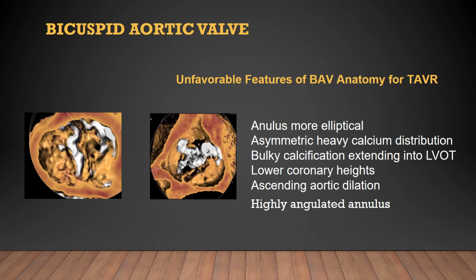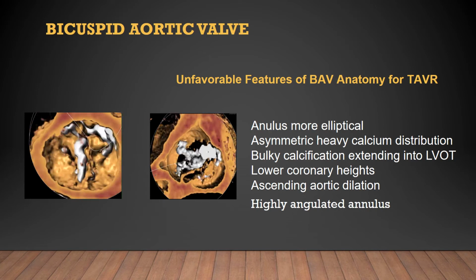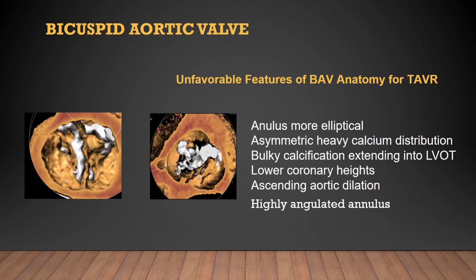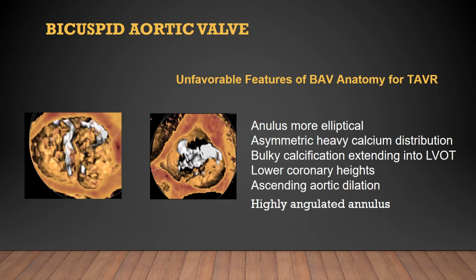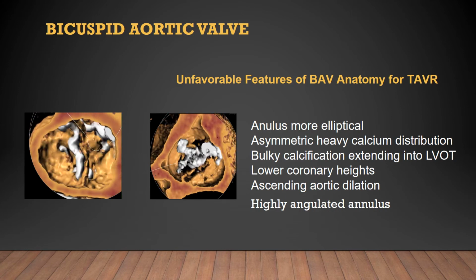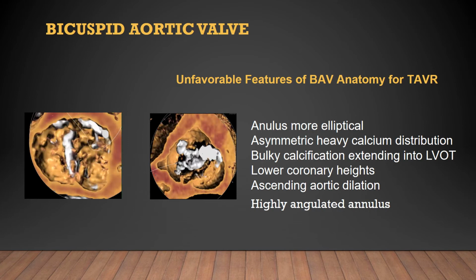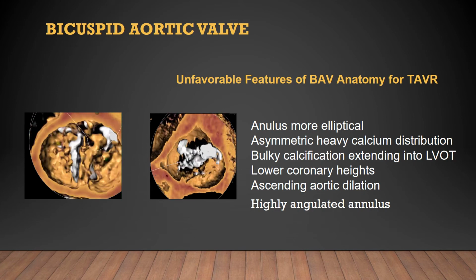Sinuses are certainly smaller in general. The sinuses are effaced, and a concern. We already spoke about ascending aortic dilatation, and also, not to be belittled, the highly angulated annulus, which would make percutaneous aortic valve replacement more challenging.